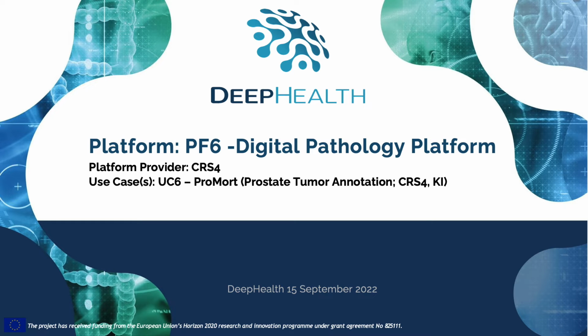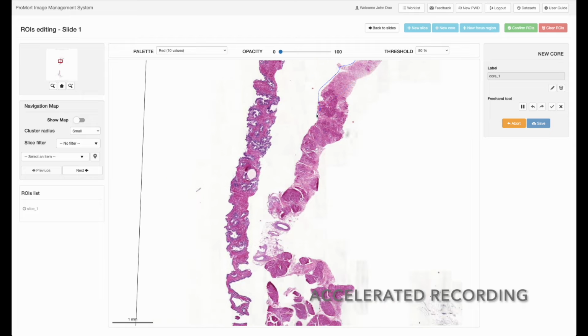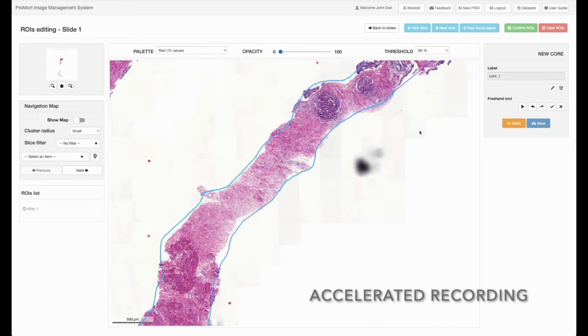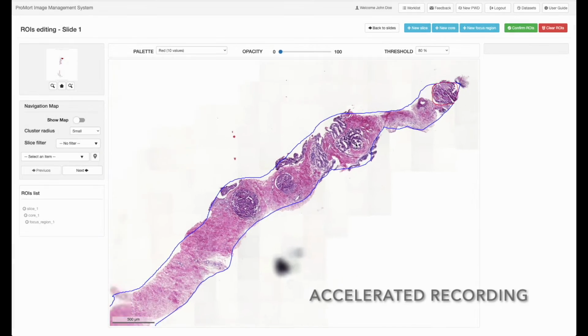The Digital Pathology Platform. The DP platform supports the creation of vertical applications for clinical research involving digital pathology. It provides built-in, ready-to-use functionality, including a virtual microscope with an integrated annotation engine that can be composed and customized for the specific application requirements.